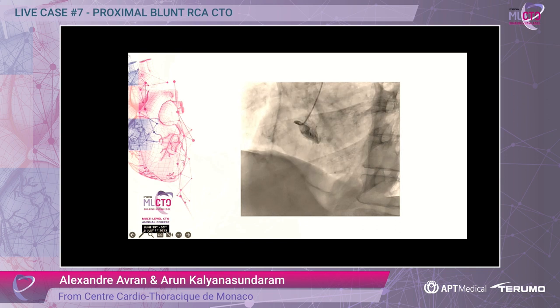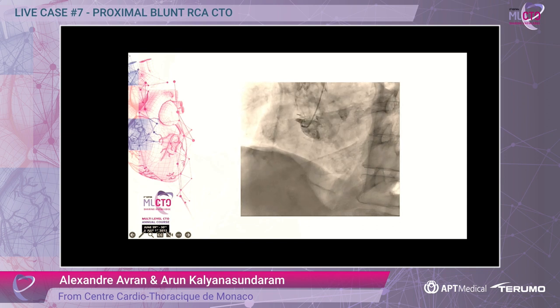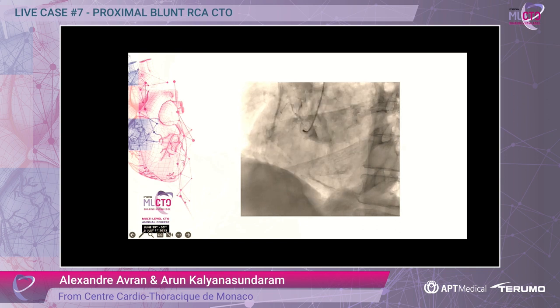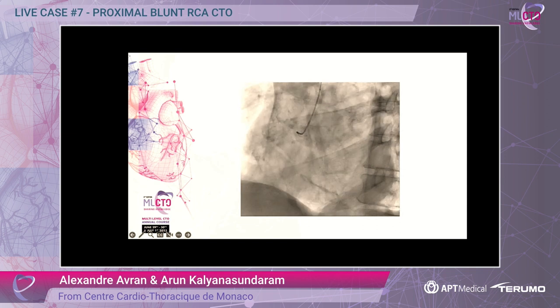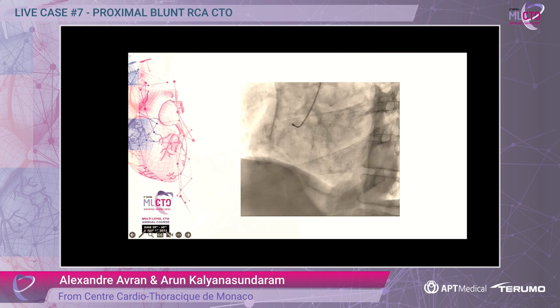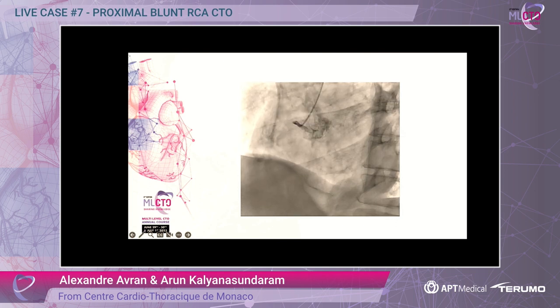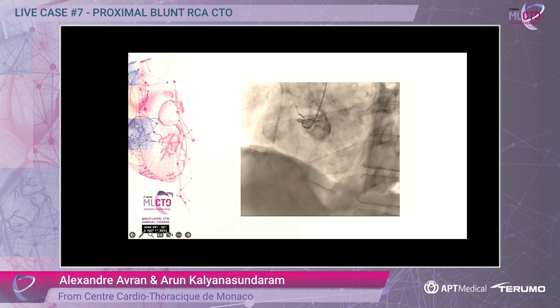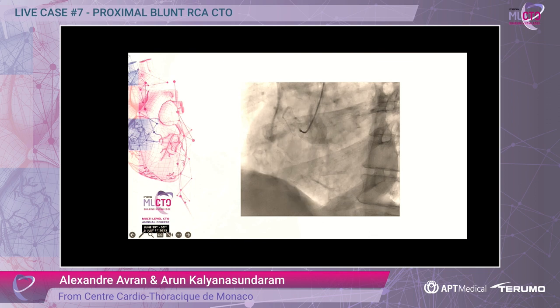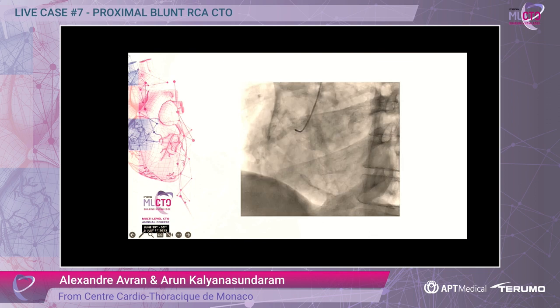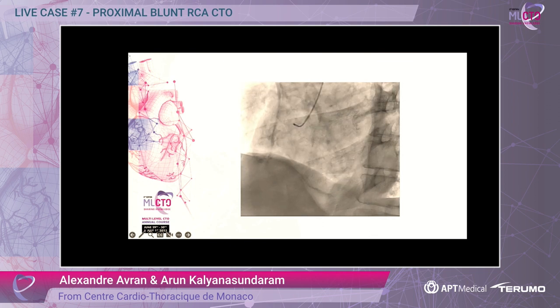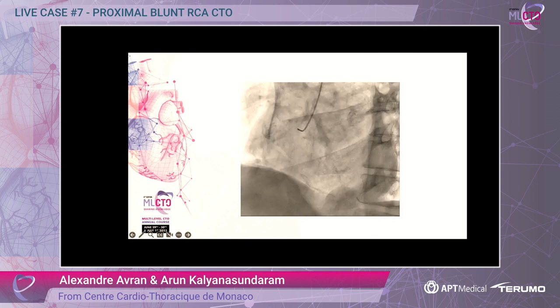So today we performed a two-puncture femoral approach with echography. On the coronary angiography, you can see total occlusion of the right coronary artery with a blunt cap. We will discuss that after.